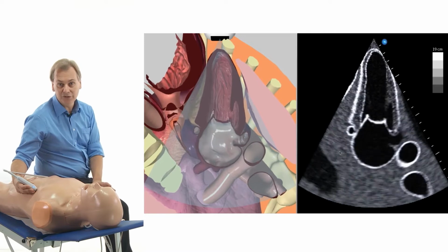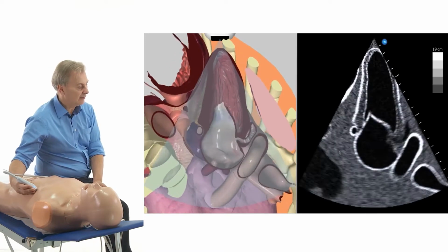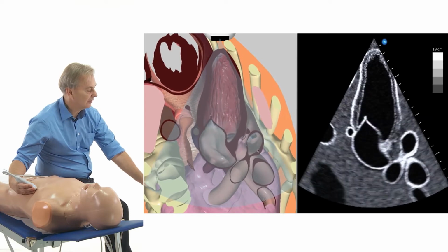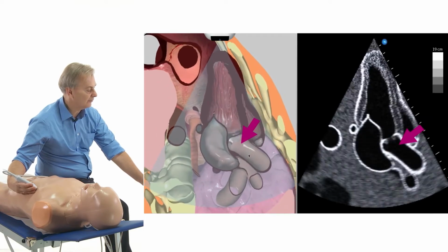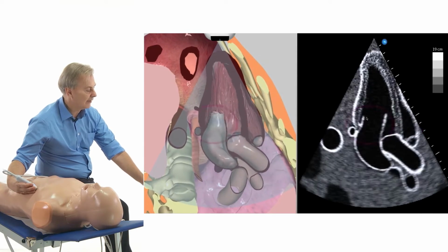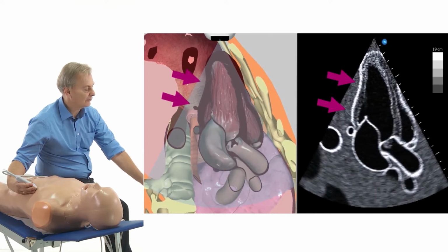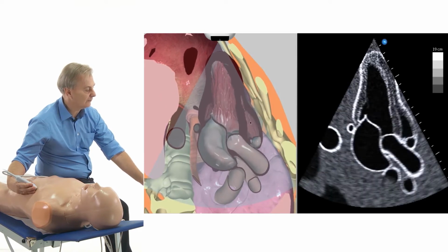So this is the 2-chamber view, and now I will continue my rotation and rotate until we get the ascending aorta into our field of view. Again, look at the image here and watch for this region. All of a sudden here the ascending aorta pops out. This is the 3rd chamber. We again see the mitral valve, and we see a little bit different portions of the myocardium here, posterolateral and anterior. We still see a little bit of the right ventricle. We're cutting through the right ventricle as well.